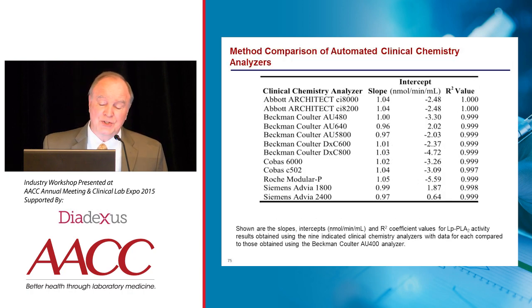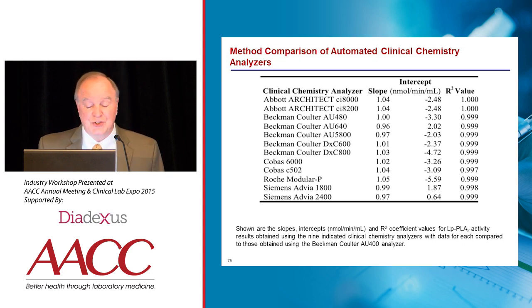Now, this is probably a slide most of us have never seen, where you've taken an assay, and in this case a kit assay, and run it on we have 12 to 13 instruments, counting the reference instrument here, which is the Beckman-Coulter AU400.